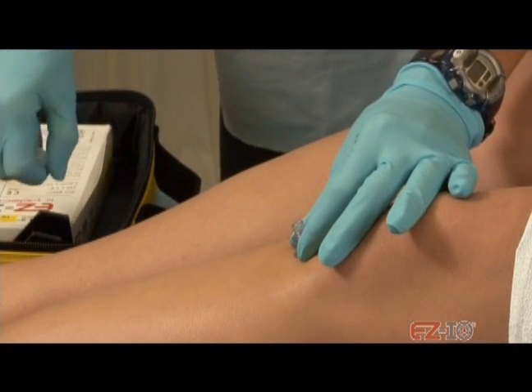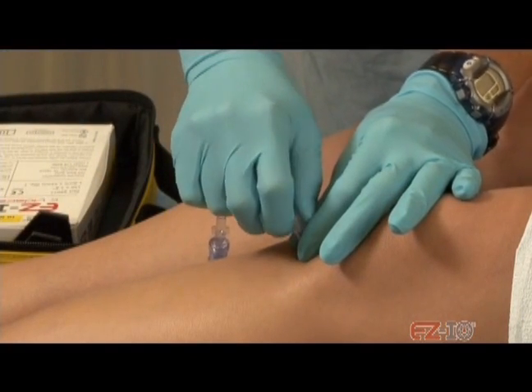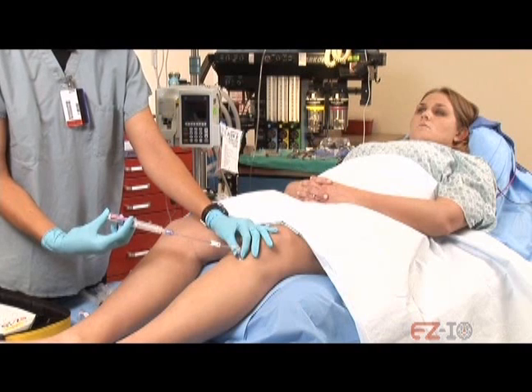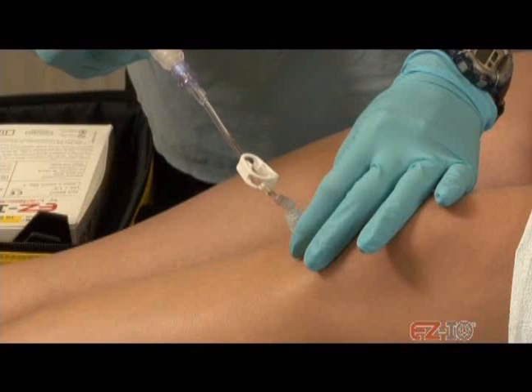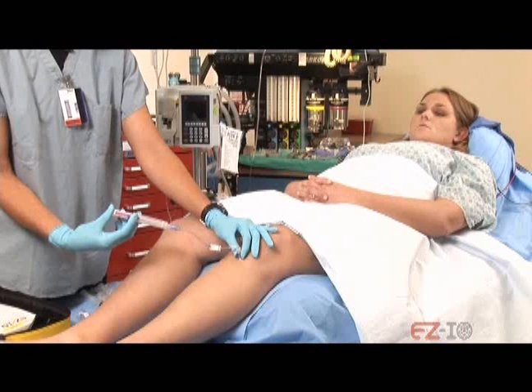This is the medication. It's going to make it numb, okay? So it's going to make it numb in there. As I'm putting it in, if I'm going too fast, if there's too much pain, let me know and I'll just slow down, okay? Here we go. Let me know if I'm going too fast. How are you doing? Fine. On a scale of 1 to 10, what's your pain? Like a 2. Okay. And now? Maybe like a 3.